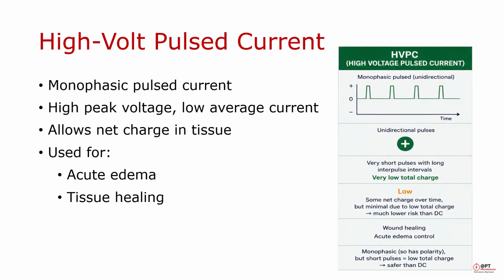First, it is a monophasic pulsed waveform. It uses a high peak voltage, but maintains a low average current, which improves patient comfort. Because it is monophasic, it allows for a net electrical charge in the tissue. This makes it useful for managing acute edema and supporting tissue healing.